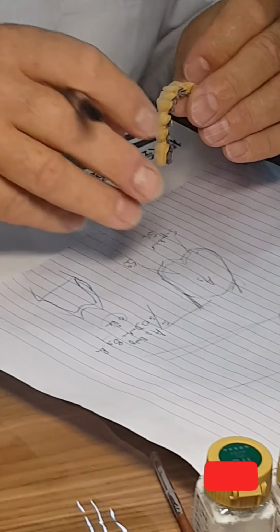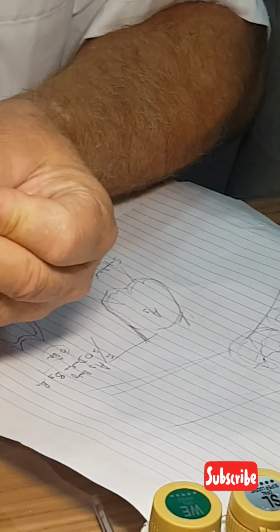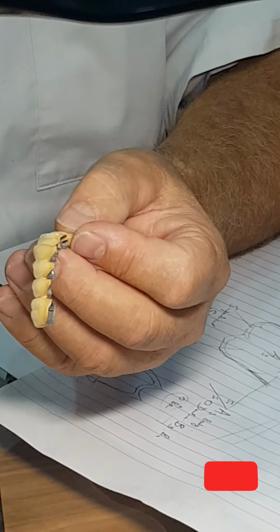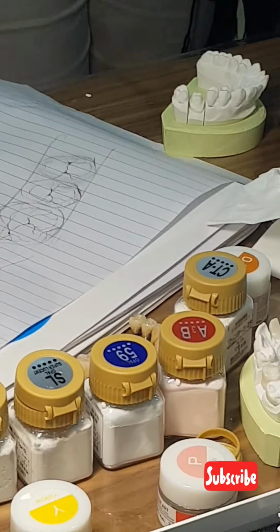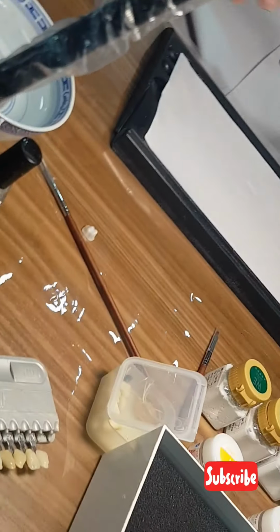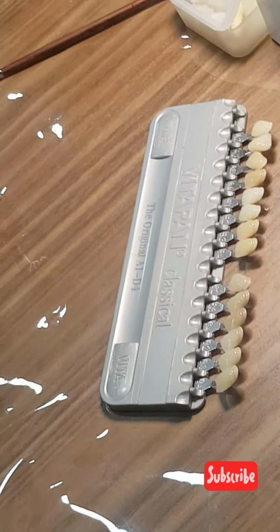You will see after firing. It's over, you can see that. You see, I have my root, and suddenly here I have something which is immediately shining, not too strong a shade. You will see. We start. I am in my laboratory. I have a lot of crowns to do, so I have no time to lose. We say A3.